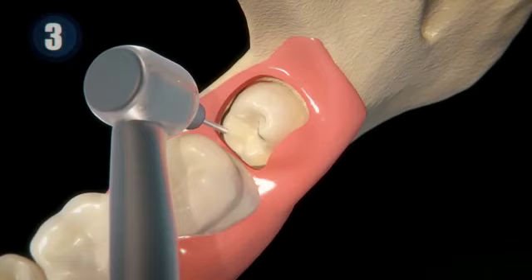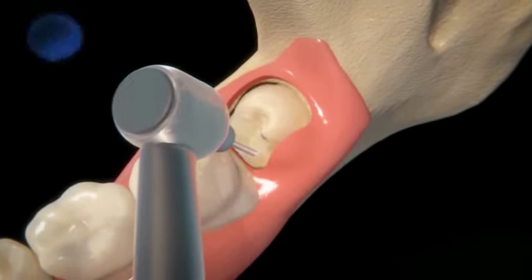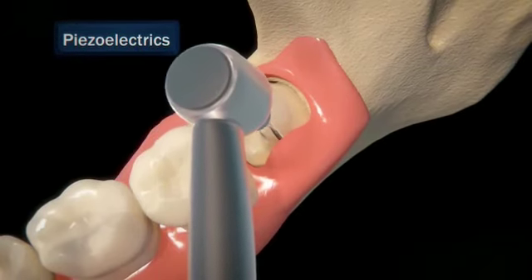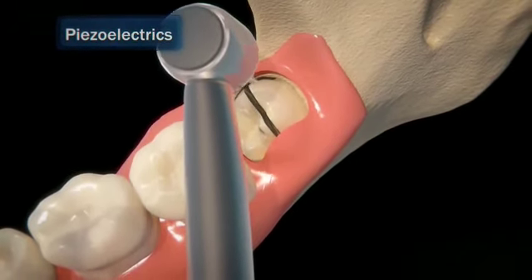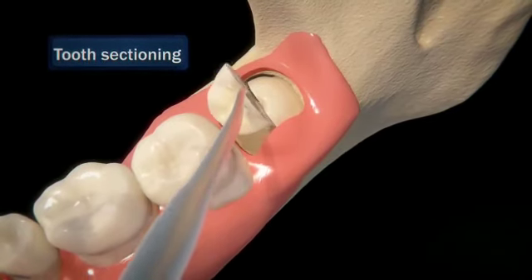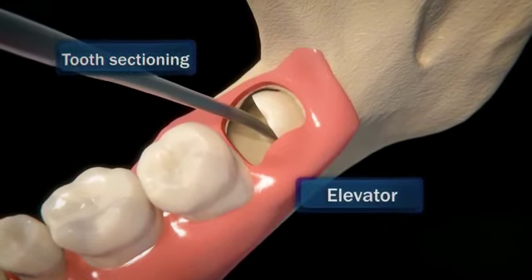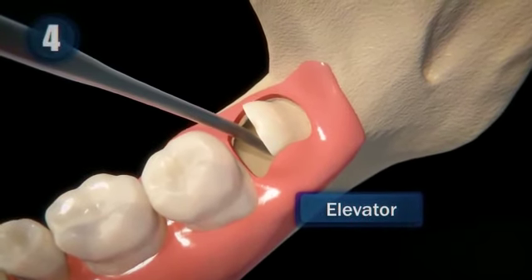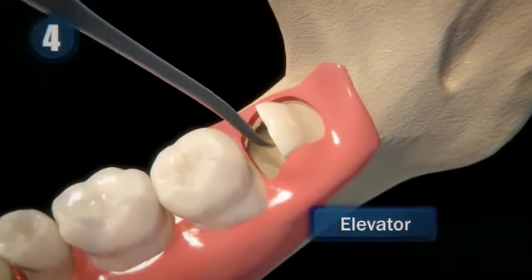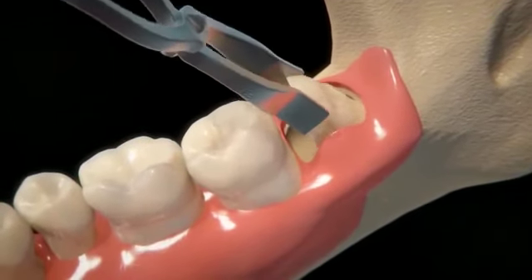Later, contouring will be carried out at the level of the tooth, bone, and then a cut in the wisdom tooth with devices called piezoelectrics, which are used to divide the tooth into parts so that extraction is easier, a process called tooth sectioning. Once the tooth is divided, the dentist will use an instrument called elevator to push the tooth out. And then with the help of metal tweezers, the expert will proceed to pull it until it is completely out.